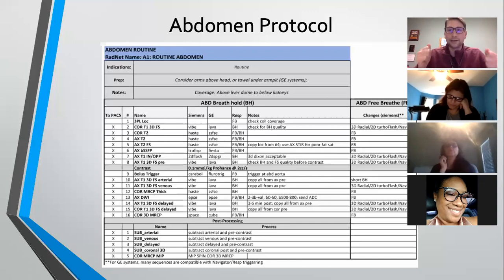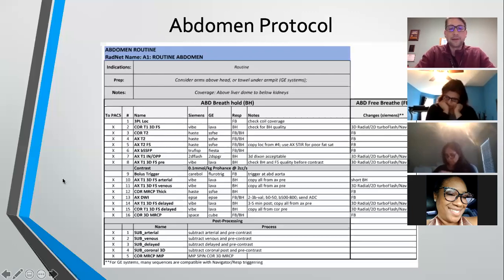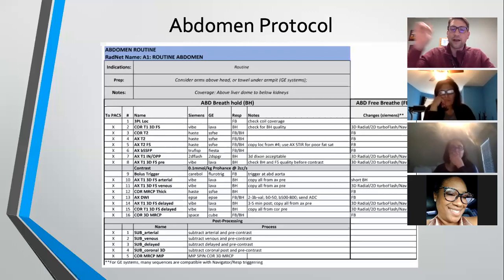Okay, I need to get ready. You'll see that contrast go into the thoracic aorta and the aortic arch, and then you'll start to see it come down into the abdomen. Boom, I need to start my sequence. And then here, it runs a couple VIBEs right after it. You get an arterial phase. And don't ever turn off your power injector after you inject.